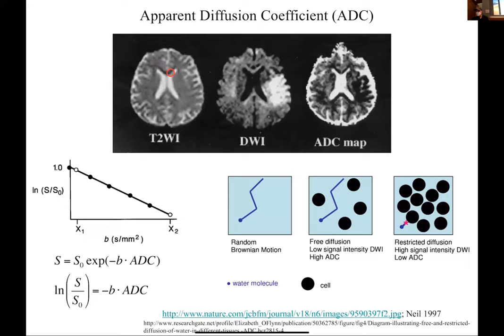This was what we looked at last time. So we said that one of the major uses of diffusion imaging clinically is to look at stroke, okay, or dead tissue. And it turns out that empirically, what's been observed for many years is this tissue that's damaged appears brighter on what's called a DWI, or diffusion weighted image. Okay. And that's because the diffusion here is less. If we look here at what's called the apparent diffusion coefficient map, you'll see here that the ADC, or the diffusivity, is lower in this region than it is in the surrounding tissue. So we have lower diffusivity here, okay, which means there's going to be less dephasing. So therefore the signal is going to be bigger where there's tissue damage.